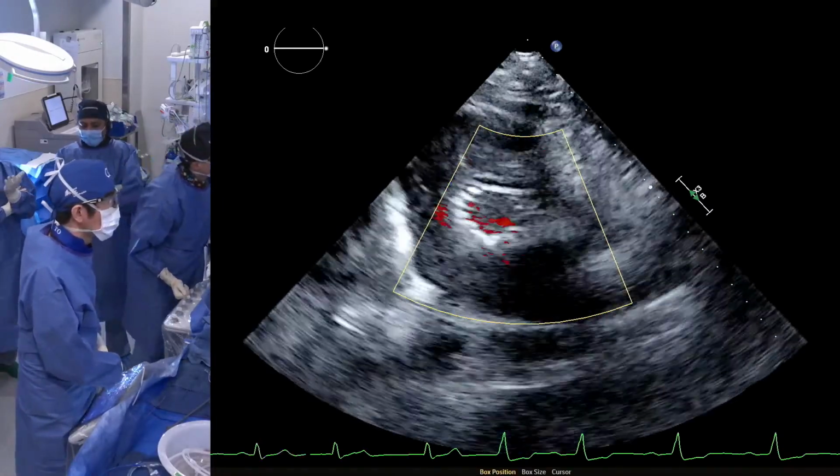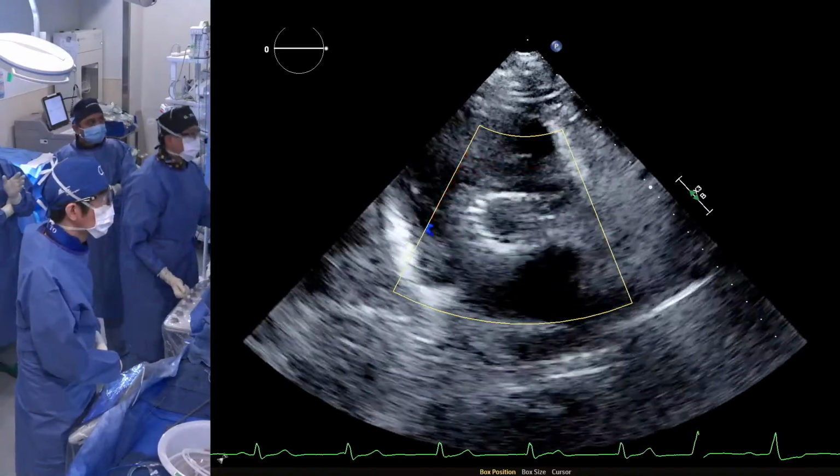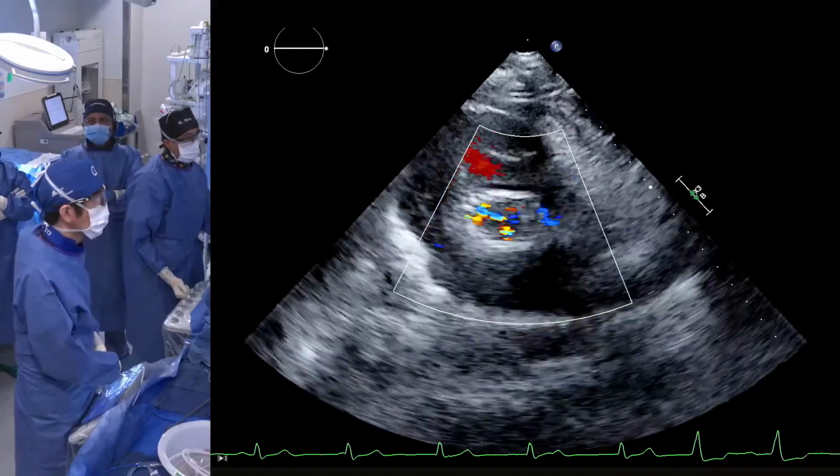Another question: could the wire still be there? The patient had a CVA before. The wire is out. Recent prior strokes, prior stroke, with some PVL. What is happening now? Show us, tell us. You go to Parastana.